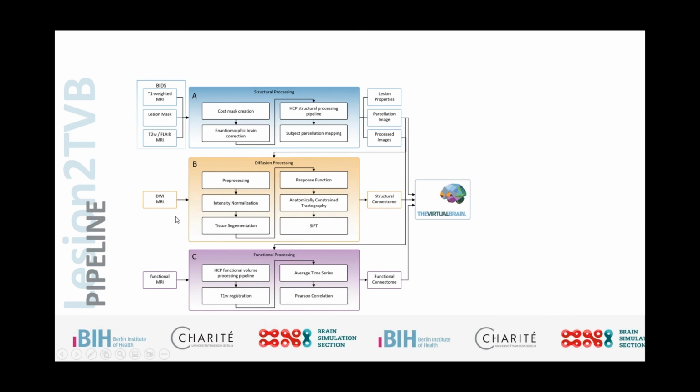And the reason why we are not using the HCP diffusion pipeline here is, again, the clinical context limiting the data acquisition. It is very rare to see stroke data that has, for example, reverse phase encoding, which is required to perform high quality distortion correction, which means that the same data is required, for example, AP, anterior to posterior, and then again posterior to anterior, really enabling us to have these scanner-induced distortions from both directions. The idea is then, if we are applying the distortion correction here, we can even them out and end up with the actual ground truth in the middle. Rather, we have just single shell, single phase encoding direction, so significantly less data and of less quality. So the HCP pipeline doesn't work.